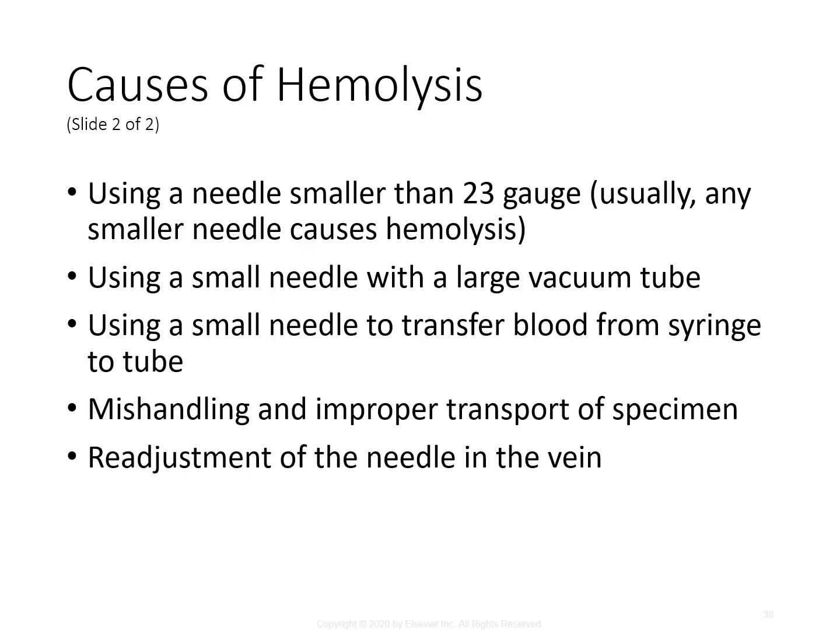There's a little bit of a consistency here, right? Smaller needles. So just keep that in the back of your mind when patients are requesting those butterfly needles. Just make sure they are aware that their sample may not be as good. There could also be some mishandling or improper transport of the specimen, and readjustment of the needle in the vein can also cause hemolysis.